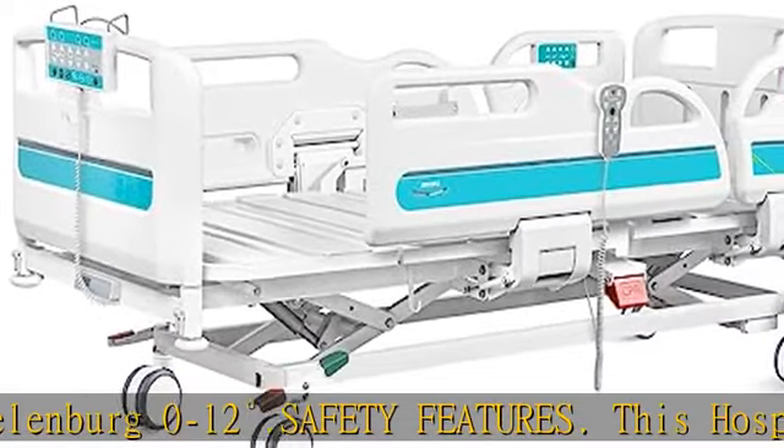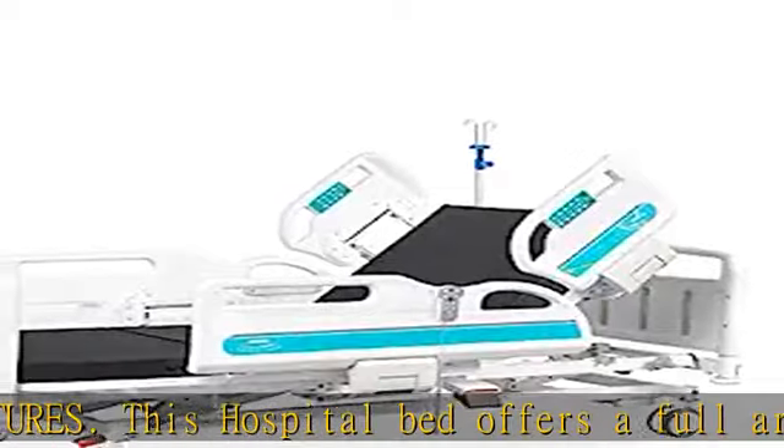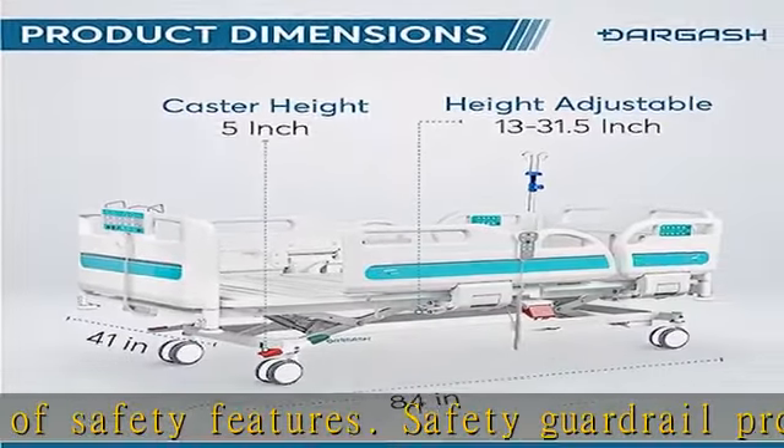Four-wall bumper wheels and mattress securing latch. Care Features: hand controller with LED light, nurse control panel, and patient guardrail side control panel.